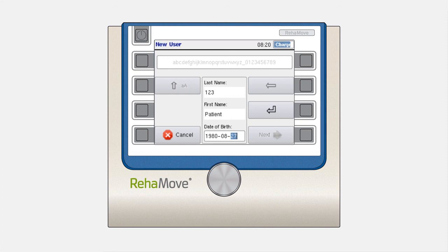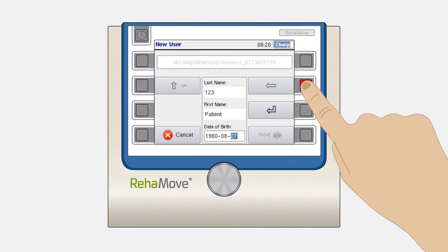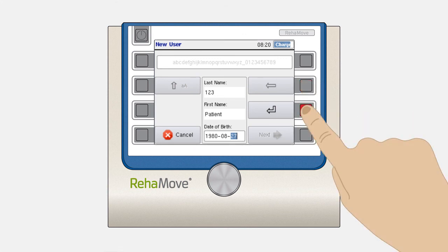If you want to write with capital letters, please press the second button on the left. To delete letters or numbers, use the second button on the right. To switch between these three lines, please press the third button on the right.